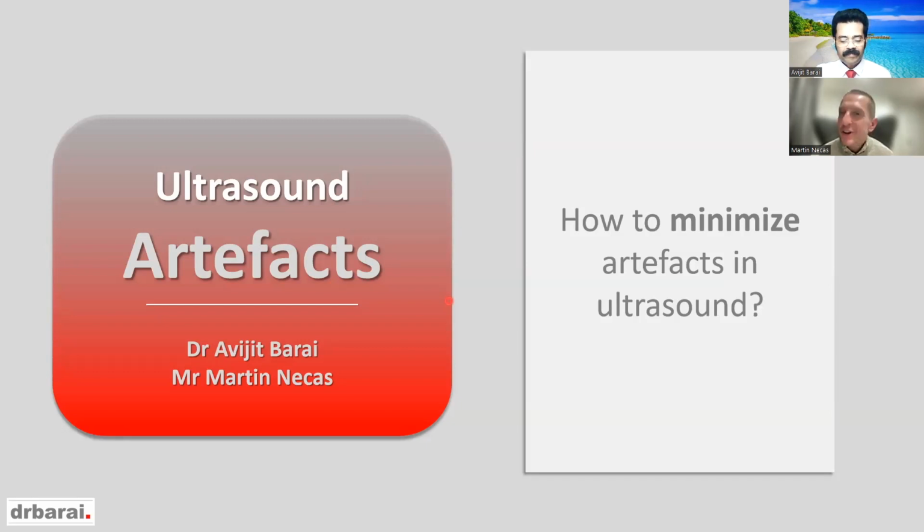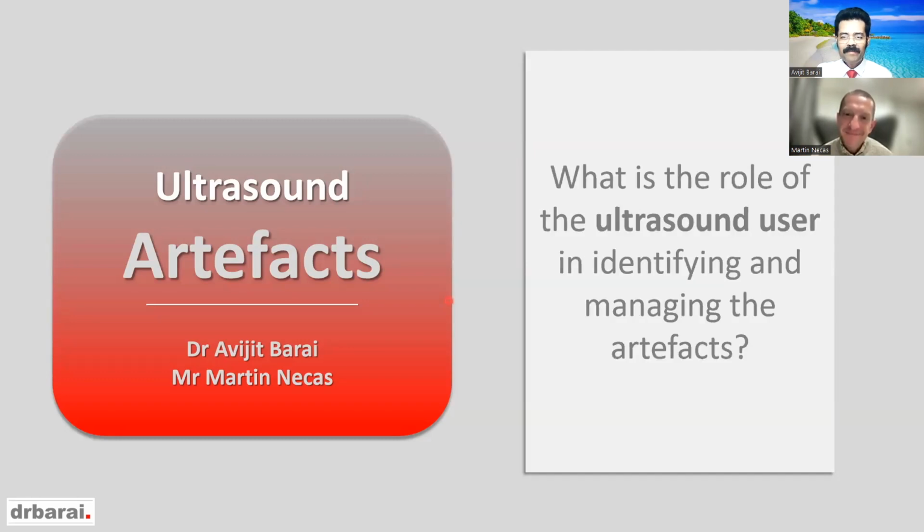Sometimes we train lots of users of ultrasound, as do you, of course, and you'll have someone junior come in and say, look, you're getting a beautiful image, I'm not getting such a good image, what button do I push? And I always remind them, there's no magic button, it's your hand finding a through-transmitting window that will get you the best result. Thank you, Martin. That's a fantastic piece of advice.